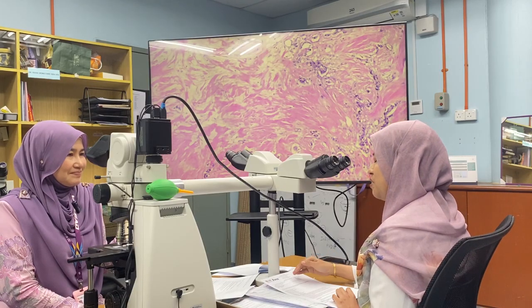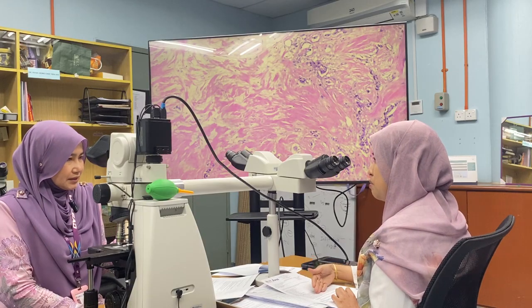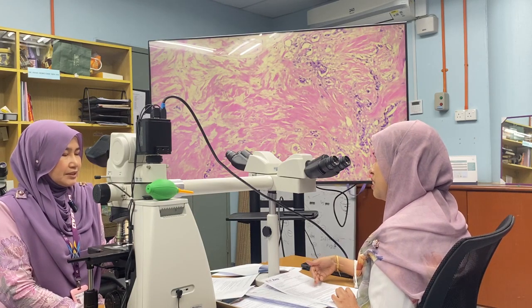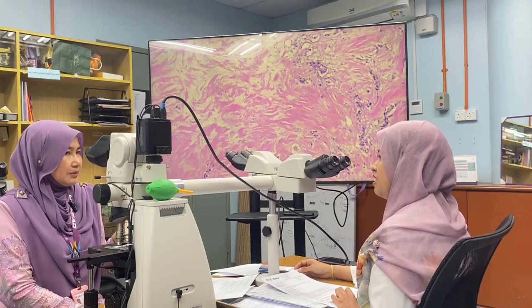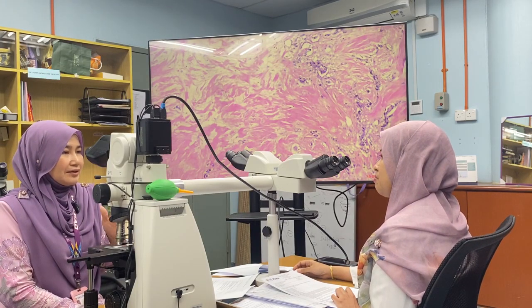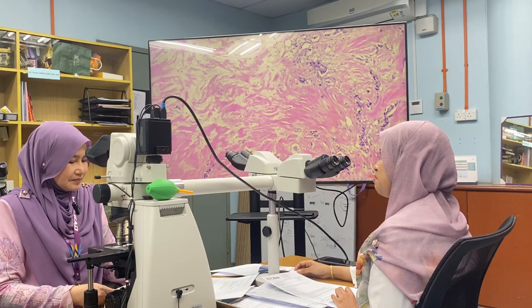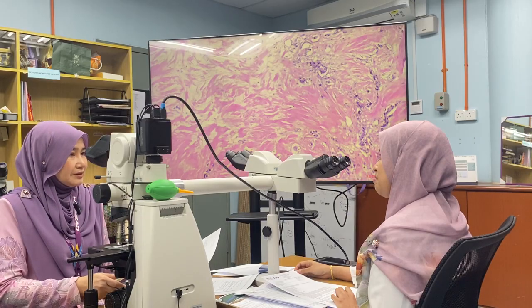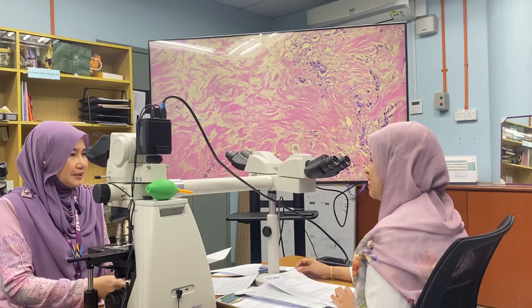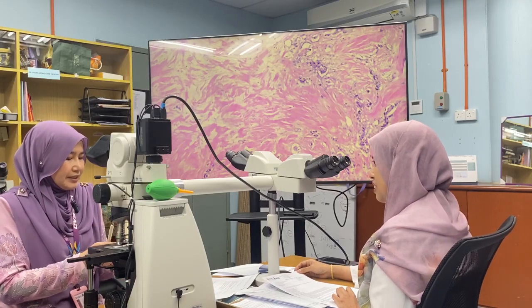May I rephrase? Do you mean if complete response, what do we call it? Complete pathological response. Yes, pathologic complete response, PCR. And when we have not complete, what do we call that? Maybe we have partial pathologic response. Yes, but we translate that into our Miller-Payne grading.